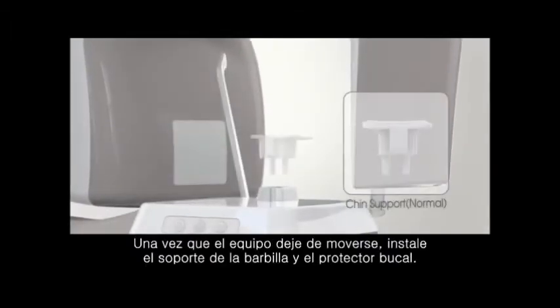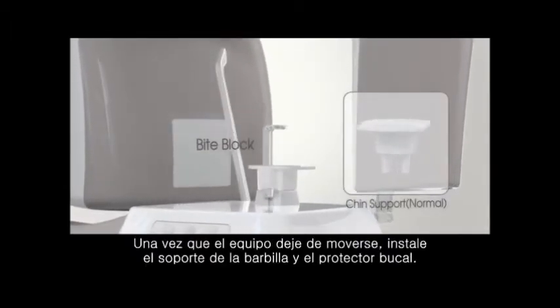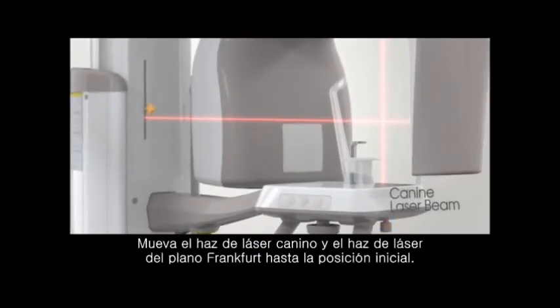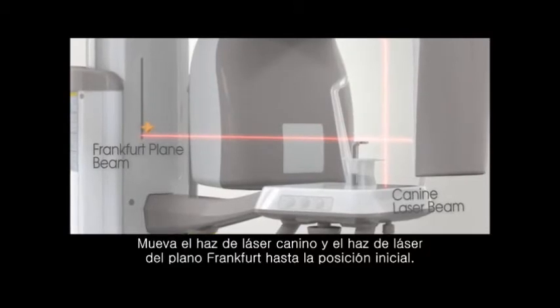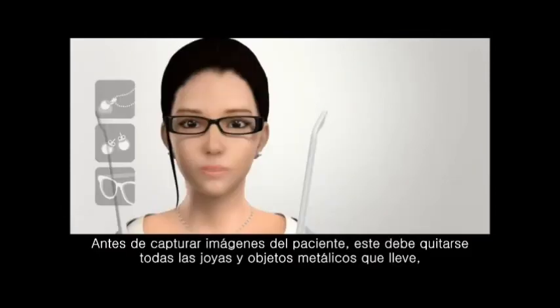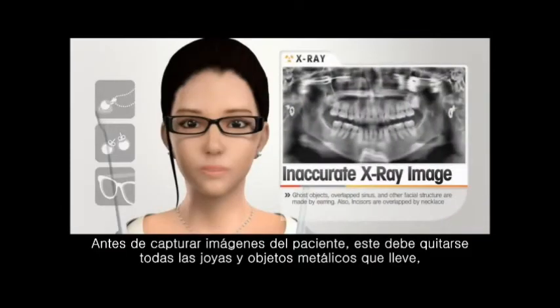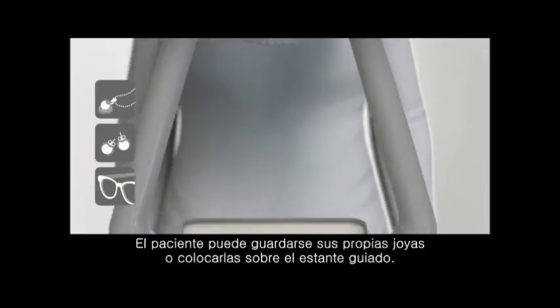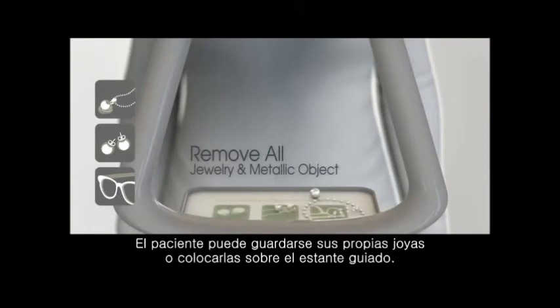After the equipment stops moving, install the chin support and bite block. Move the canine laser beam and the Frankfurt plane laser beam to the initial position. Guide the patient to the unit. All jewelry and metallic objects such as necklaces, earrings, hairpins, eyeglasses, dentures, and orthodontic appliances should be removed before patient image capturing. Patient can keep their removed jewelry personally or place them on the guided shelf.